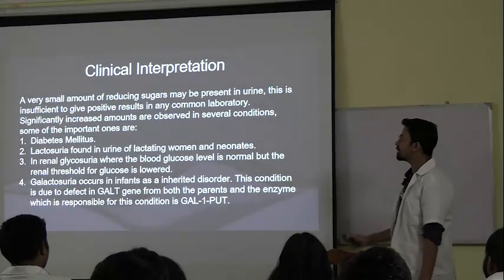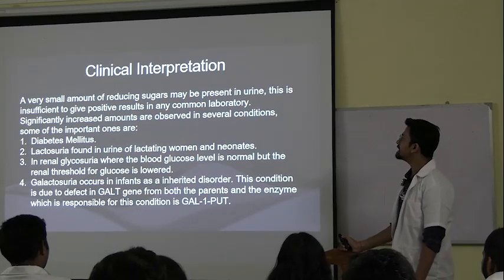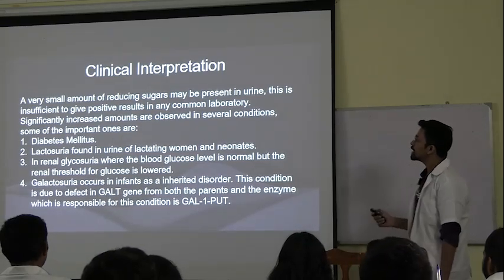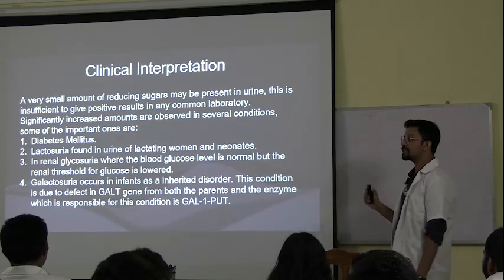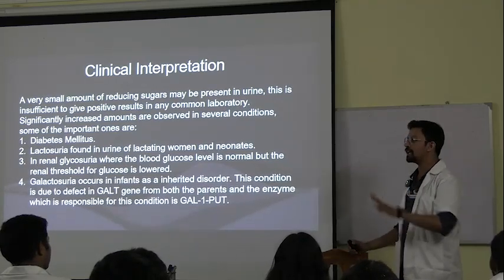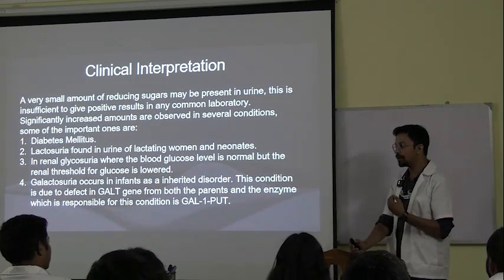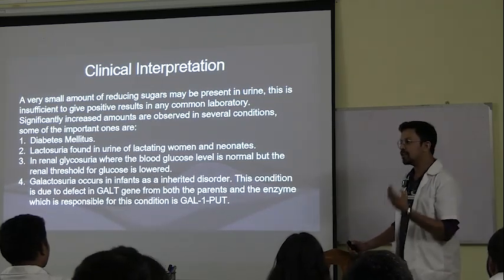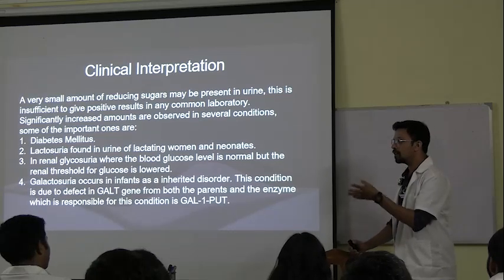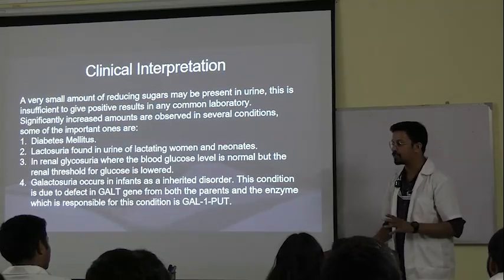Now, some clinical interpretation. A very small amount of reducing sugar may be present in urine, and this is insufficient to give a positive result. That I was saying in the first line, that if the constituents are less, it might give you a negative result because the test sensitivity is low. We are doing it as a bedside test, just to know whether the patient is having reducing sugar in the urine or not. That's all. That is why the test sensitivity is also less.